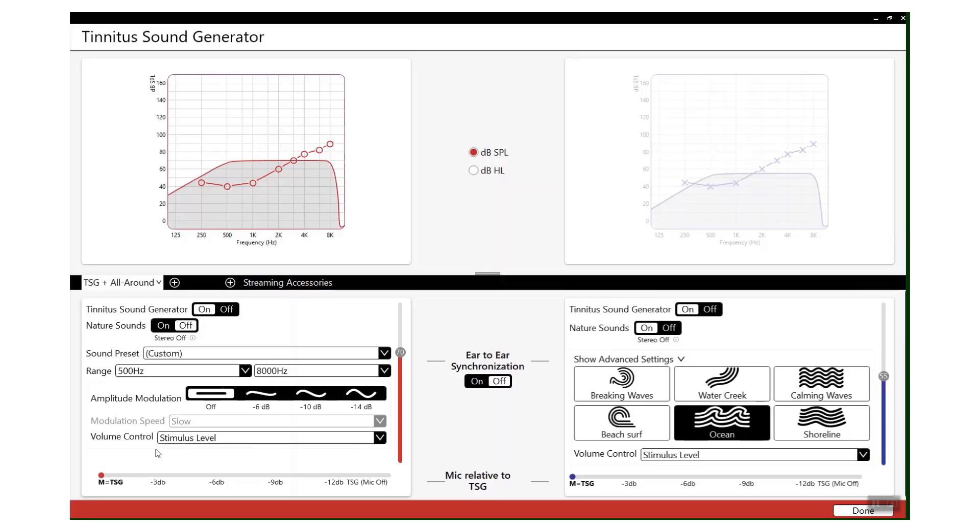As the environment becomes more quiet and their tinnitus is likely to become a little bit more prevalent, it will then increase the tinnitus sound masker and therefore keep it at a nice and comfortable level.